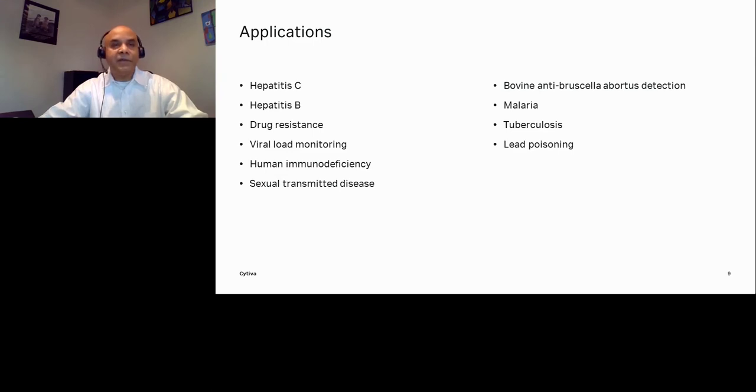It's called HTLV. HTLV-1 has been recognized as the causal agent of adult T-cell leukemia. Transmission may occur by several means, including breastfeeding and through contaminated blood. In order to assess the extent of HTLV, or human T-cell leukemia lymphoma virus, in women of childbearing age, a modified gelatin particle assay costing very little per test was used to screen thousands of DBS obtained from neonates.